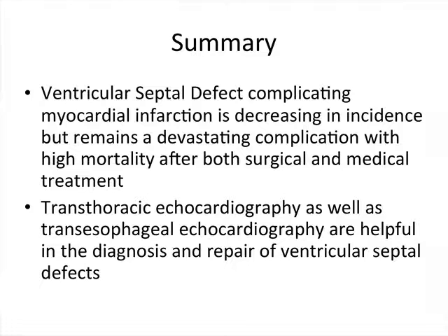In summary, ventricular septal defect complicating myocardial infarction is decreasing in incidence but remains a devastating complication with high mortality after both surgical and medical treatment. Transthoracic as well as transesophageal echocardiography are helpful in the diagnosis and repair of ventricular septal defects.